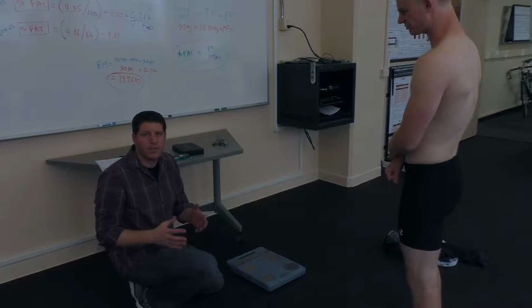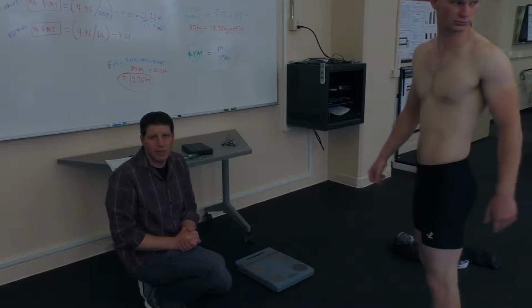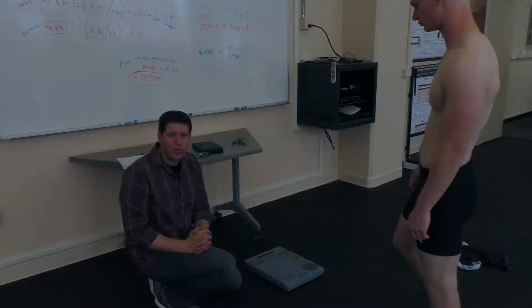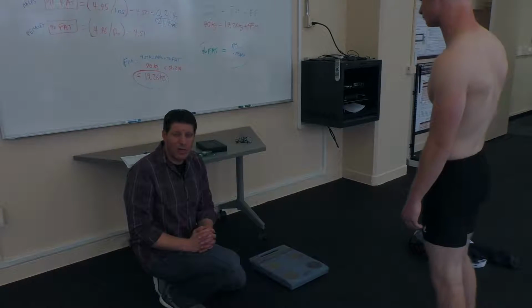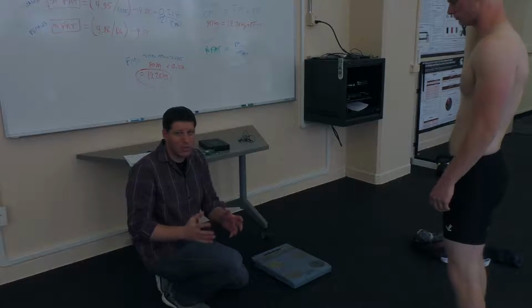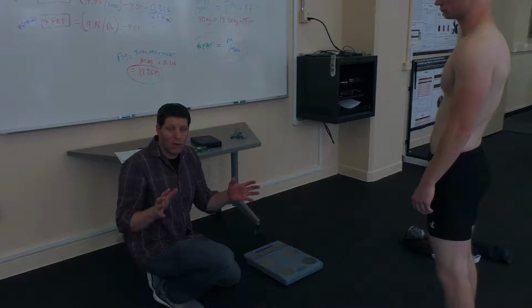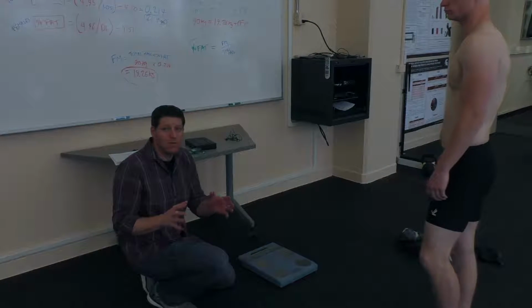Bioelectrical impedance analysis is another method of body composition assessment. Some people consider these to be random number generators. I wouldn't go that far, but it's certainly not my top choice, even compared to skin folds. Now, BIA devices come in a very wide range of appearances and even methods.